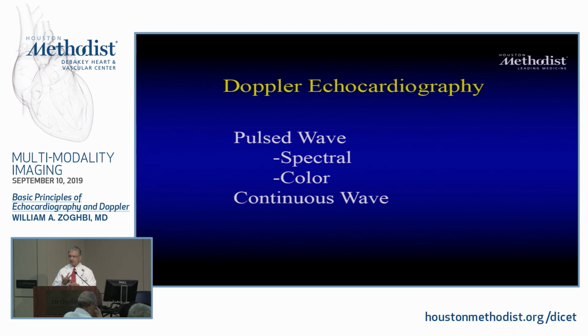Yes, you'll use it most of the time. You may want to decrease harmonics, use fundamental, in case you're seeing something that is thicker than usual and should not be thick. Use harmonics with contrast agents, so you can enhance them. And I don't think we usually have an issue with that because there are settings for contrast when you use them. So I think we're okay with that.